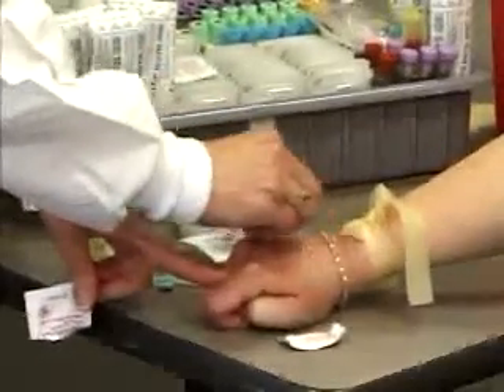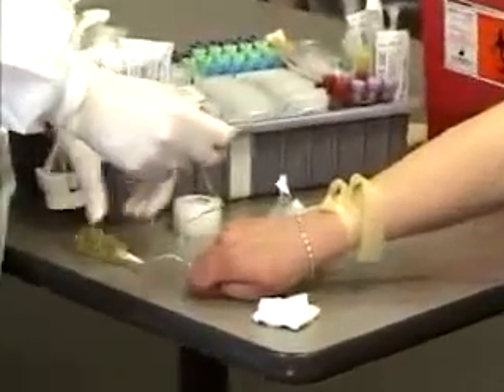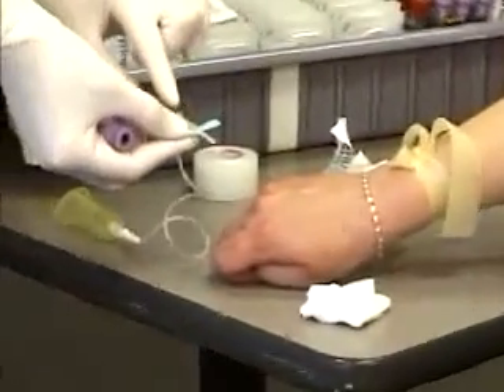Clean the site once again in a circular motion and let it air dry. Then take your butterfly and take off the cap. This is a safety butterfly, so the yellow device is the safety part that we will not use until the very end.